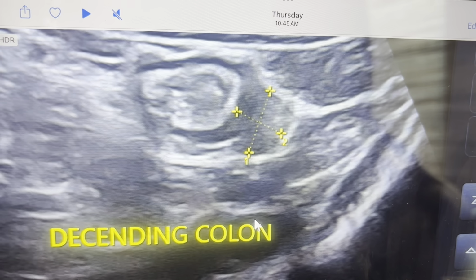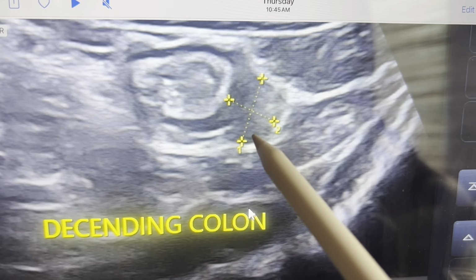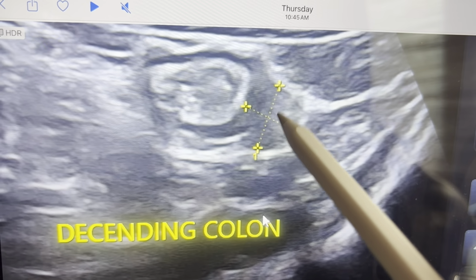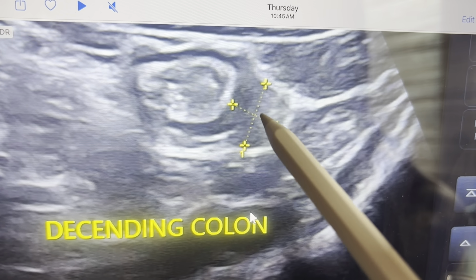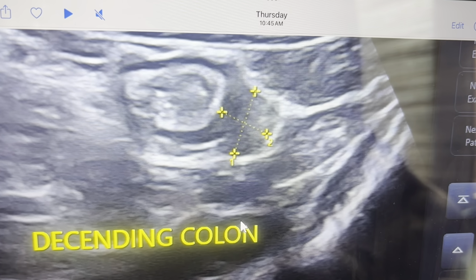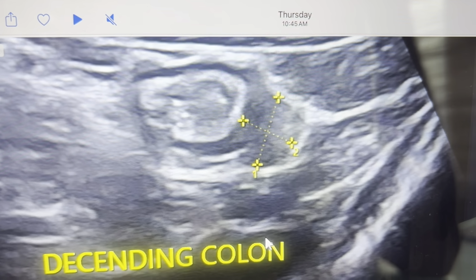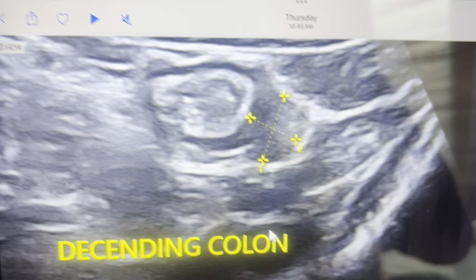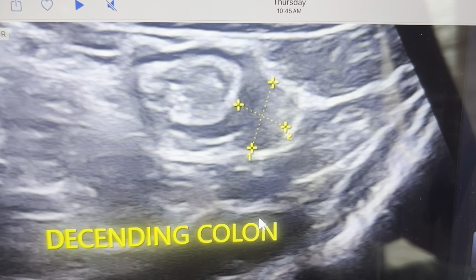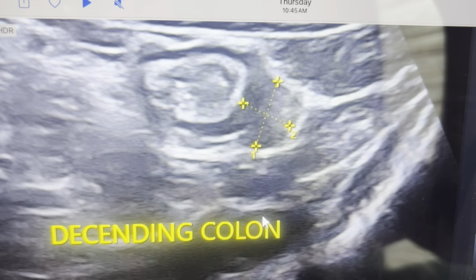Now how do we diagnose whether this mass is a normal mass or an inflamed epiploic appendage? Normally, we generally don't see a mild-grade epiploic appendage, because it is not so common that we see this kind of epiploic appendage very frequently. But sometimes when the epiploic appendage is inflamed, it becomes a little bit edematous and hypoechoic.